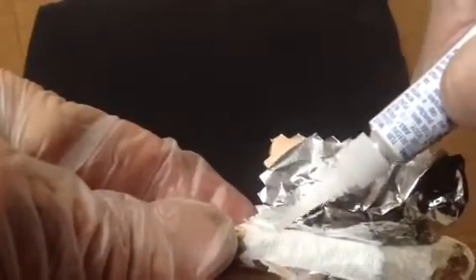I've got a nice smooth layer of foil on top of the repair, and that just has to set for a couple of minutes. Then we peel the foil back enough to saturate more of the cellulose. I'm super gluing another area of the cellulose, and I'll wrap the aluminum foil up from this other side. I can overlap the aluminum foil onto itself.